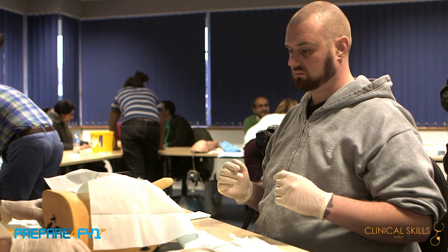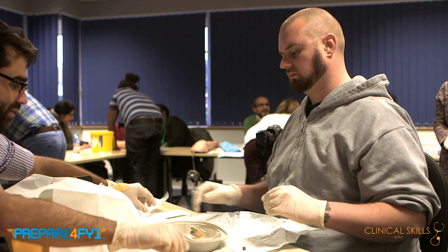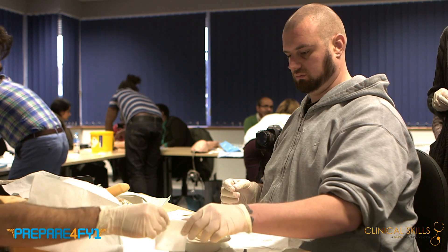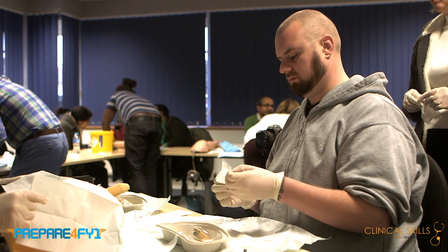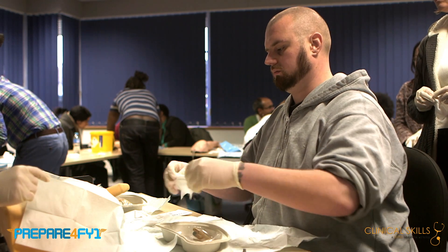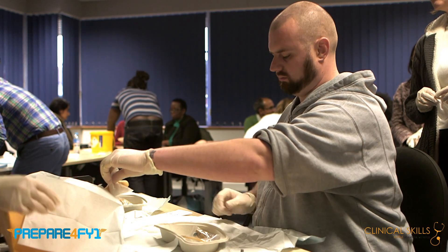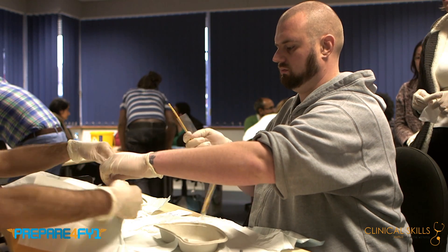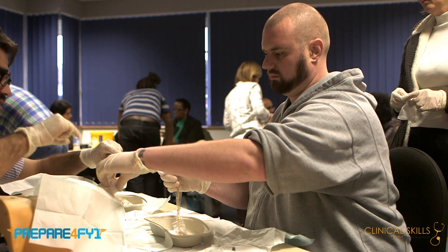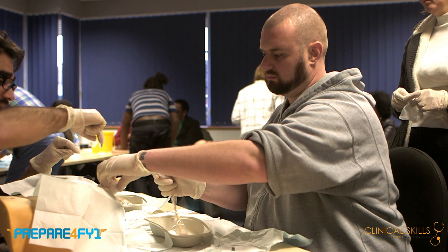Move the field back a little bit and bring your sterile field around across, and then you're in a position where you can start catheterizing the patient. Make a swab sling and put it around the penis. This is the bit where if you hold the penis through the swab, it allows you to grab the catheter with your fingers as you're inserting it.